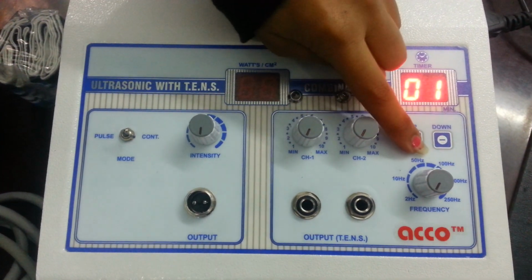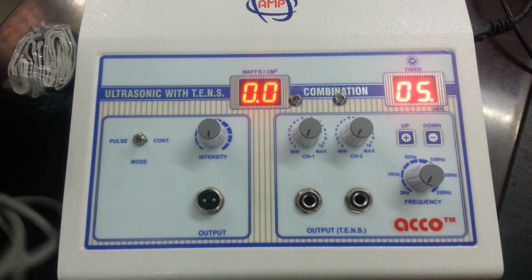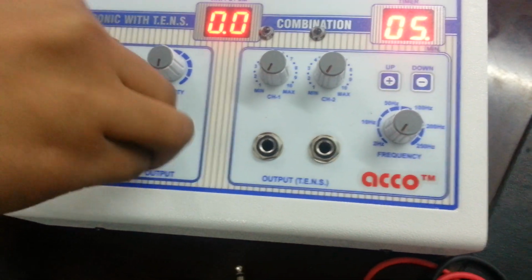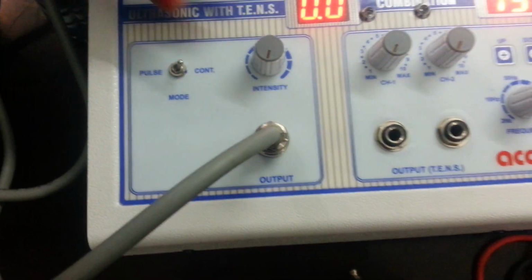Set the timer as per your need. Timer up, timer down. Now attach the wire and handle. Set the mode as per your need, continuous or pulse. Now increase the intensity as per your need.